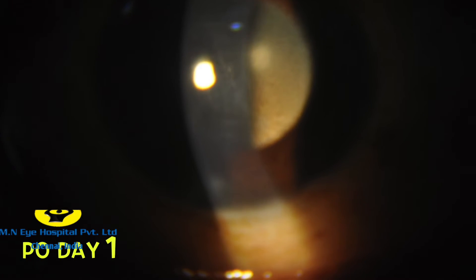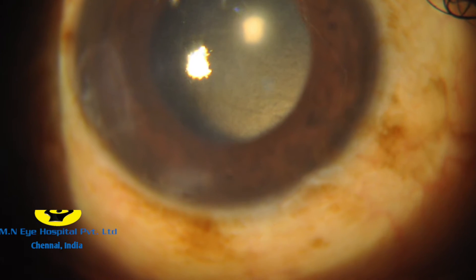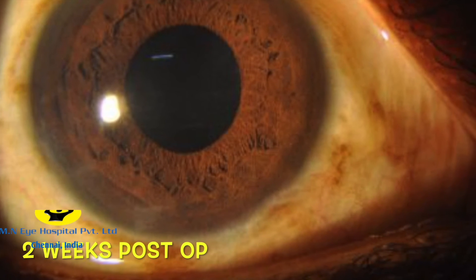Post-operative day 1 showed diffuse corneal edema and few Descemet's membrane folds in the center. Topical steroids and antibiotics were started, and two weeks post-op showed a clear cornea, well-centered IOL in the bag, and excellent visual recovery.